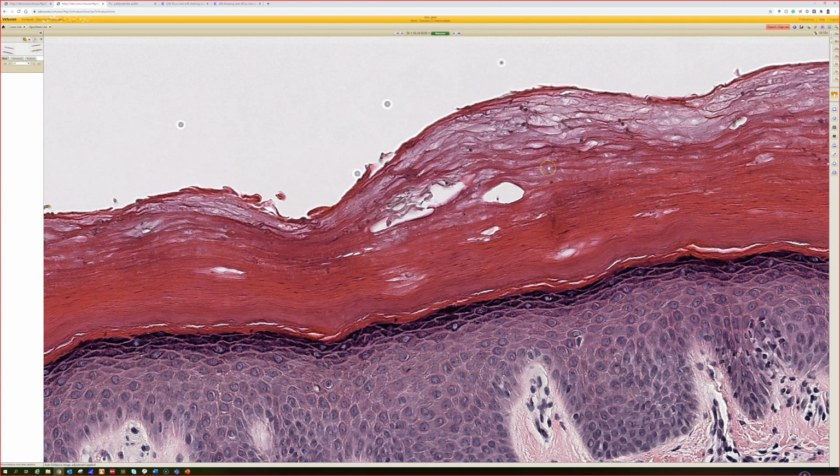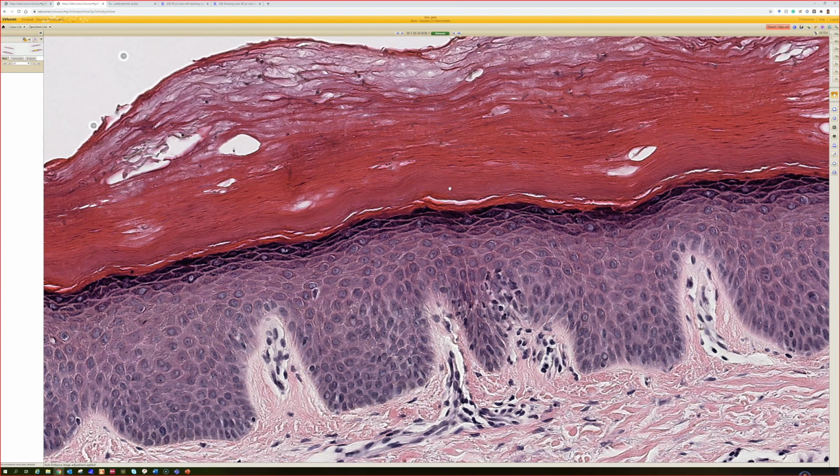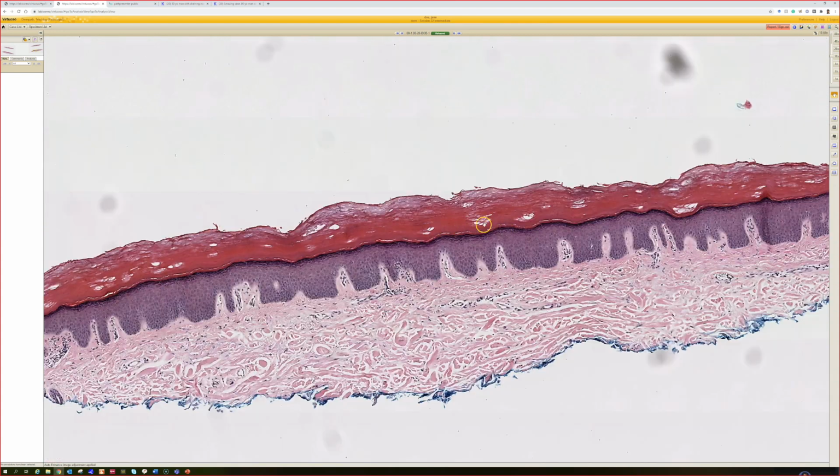Same kind of fungi that basically cause chromoblastomycosis and pheohyphomycosis, which is basically an invasive infection by these types of fungi. But this can mimic melanoma clinically because it can be an acral pigmented patch that's growing relatively quickly, and so that prompts concern. But I feel like the few cases I've seen were just like this. They had essentially no inflammation. And you could argue the corneum's a little thick, but it's acral skin. The corneum is in general pretty thick there.